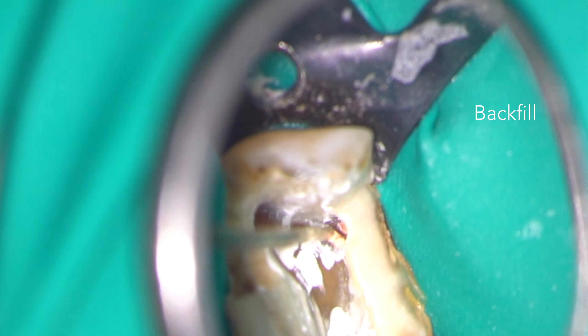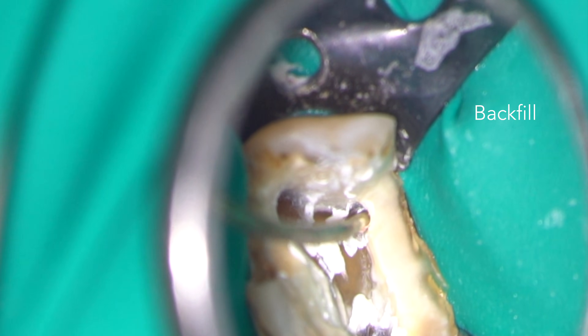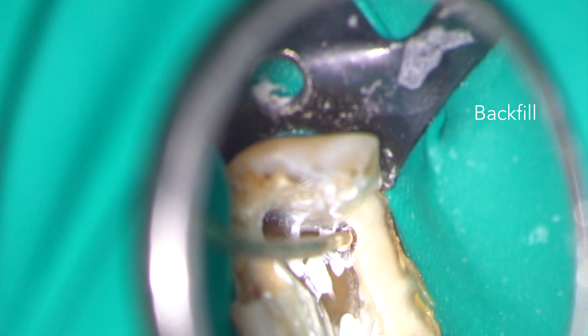Backfilling is easily carried out using a thermoplasticised gutta-percha technique — in this case, Obtura.